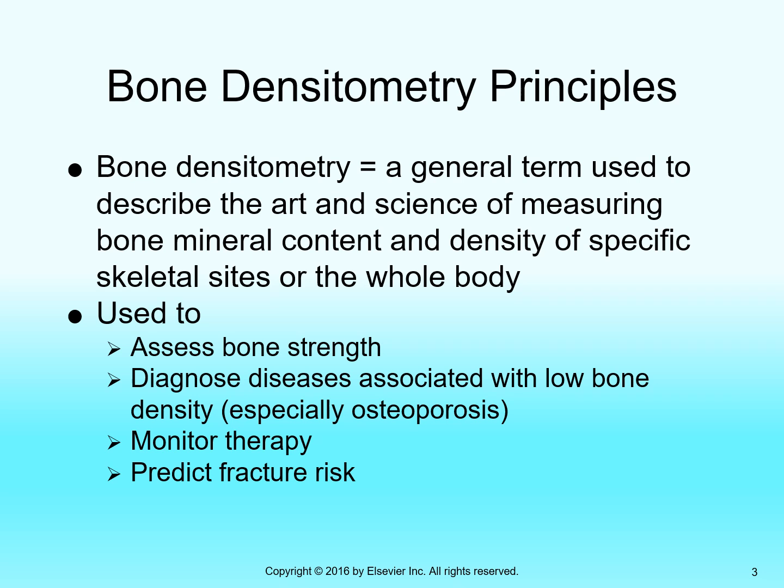We can assess bone strength with it because there's a certain threshold of calcium necessary to support the bone structure and all the additional soft tissue structure that the bone is holding up. We can diagnose osteoporosis with this exam.